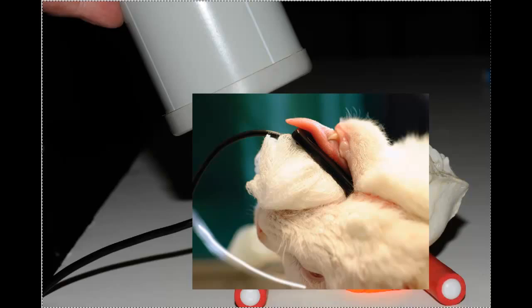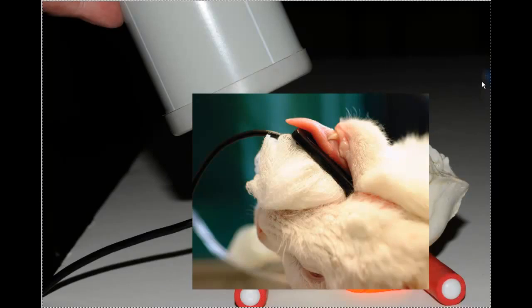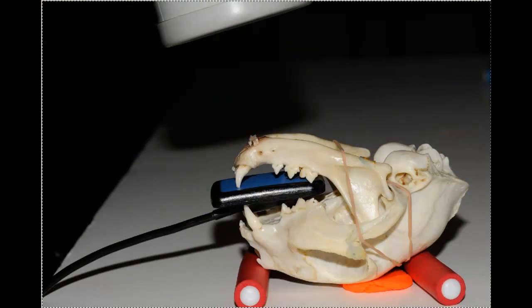So, in this particular instance, the tooth might be like so, our sensor is about like that. And so, our angle would be something like that. So, we can't see the tube or the cone of the x-ray in place, but if we could, it might be looking something like that. That would probably be pretty close to the angle that that would be shot at.